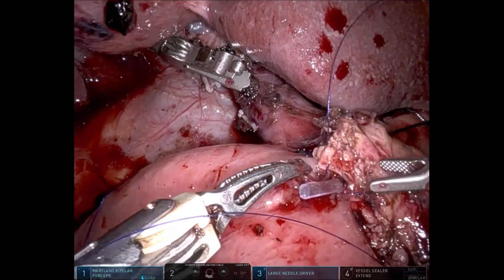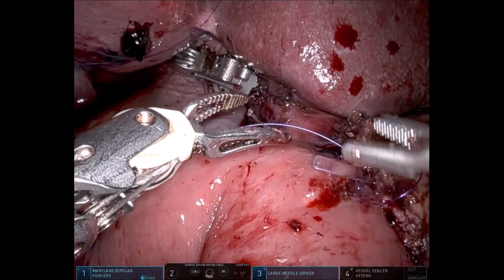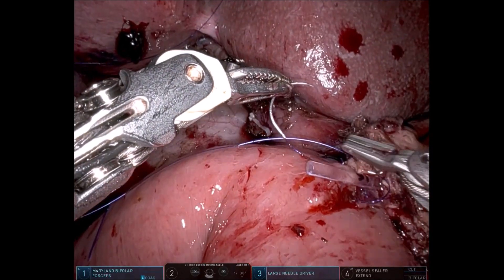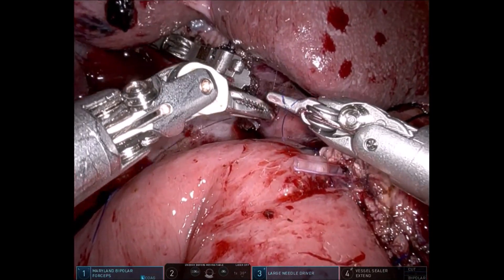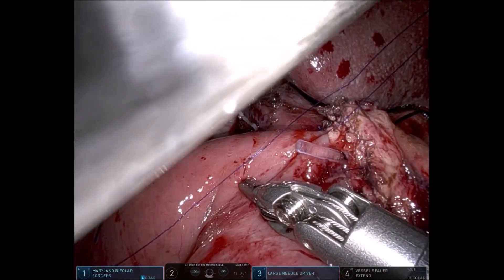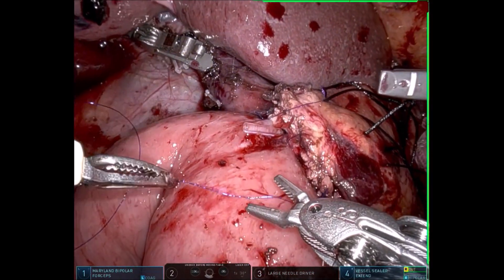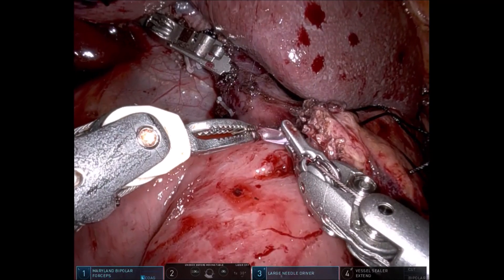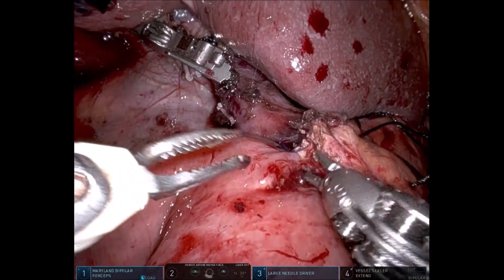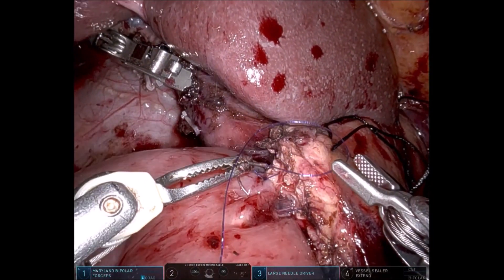We then start the anterior layer of suturing, taking the first bite at the 9 or 10 o'clock position, which is tied. Care is taken not to include the feeding tube in the sutures. We square the knot by taking the hand to the other side, ensuring the knot sits snug and doesn't get loose. Once both corner sutures are placed, we insert the feeding tube into the jejunum and confirm it passes easily.